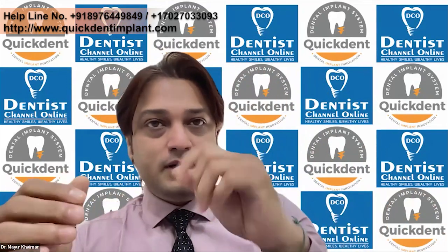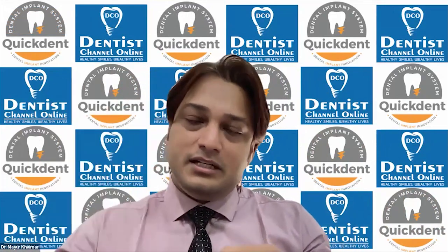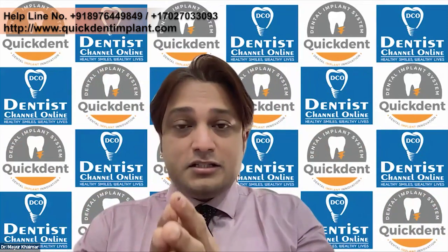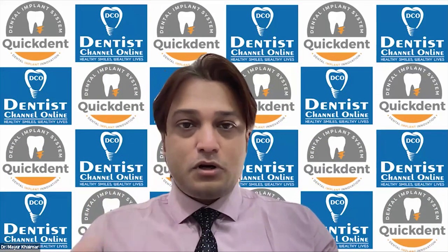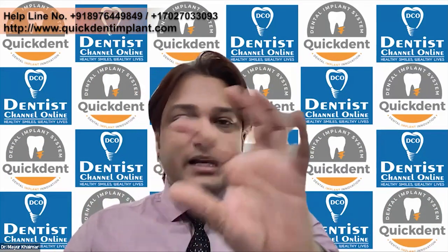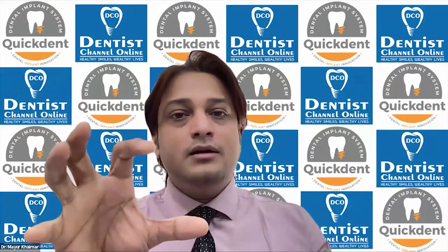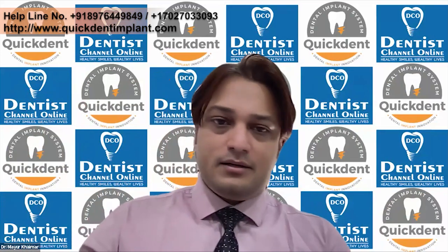Hybrid means two different materials: metal inside, and over that some kind of teeth setting or shell. I've shown you. And if you have too much inter-arch space, in that case never go for PFM. That's not the gold standard; it will be very heavy. Instead, go for either a titanium metal bar with the prosthesis over it, or a cobalt chromium bar with a shell prosthesis over it. That is nothing but HIPC. So you should go for that.